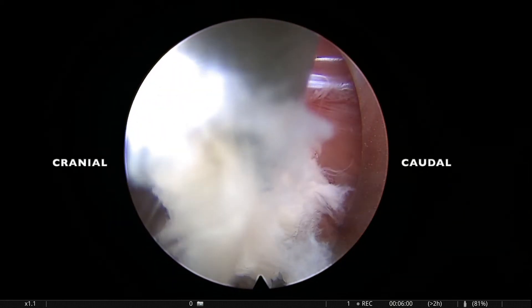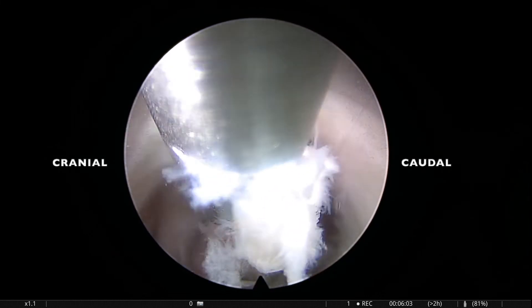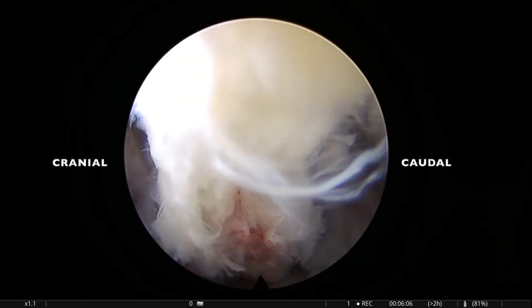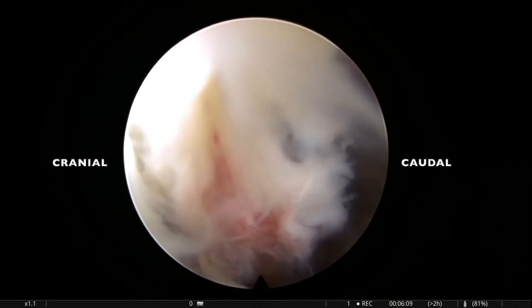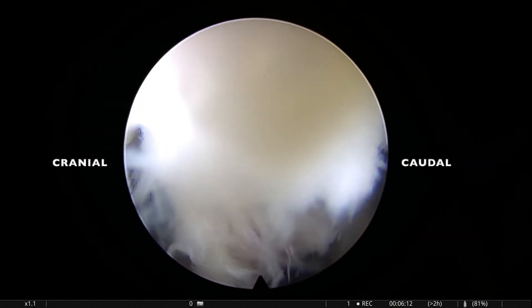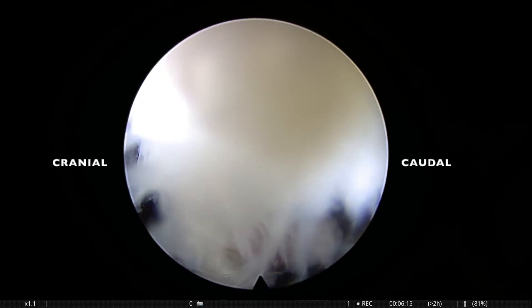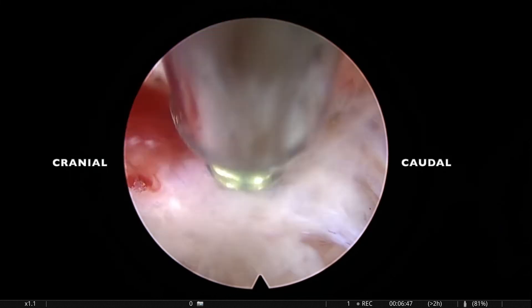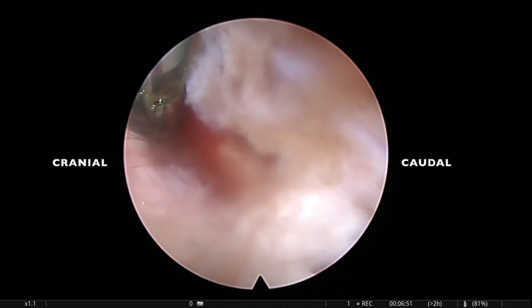You can see the fragment coming out with a blood-tinged epidural component, which has been removed. Once the fragment is out, you should not be satisfied — you should search for more fragments, because sometimes the fragment gets fragmented.